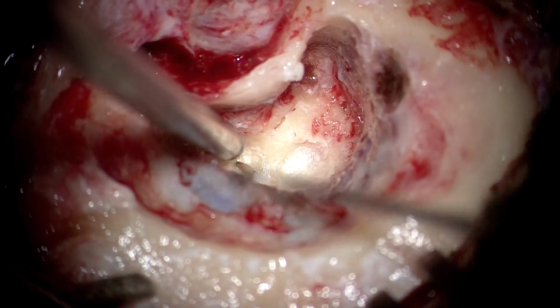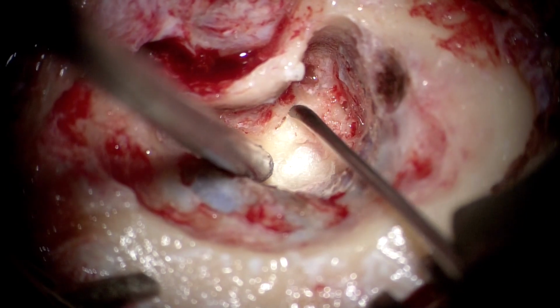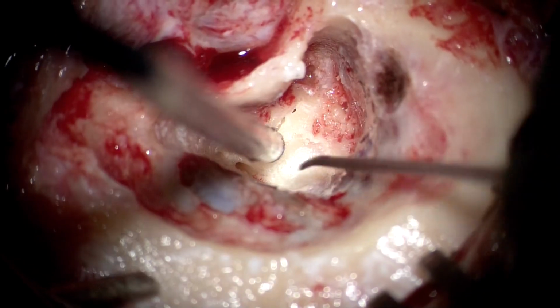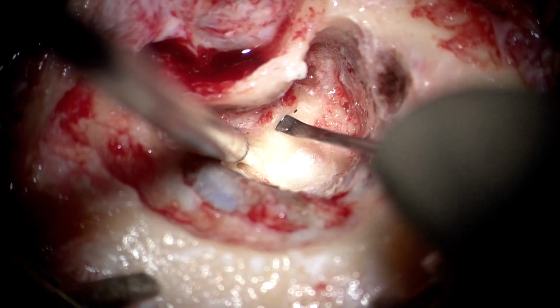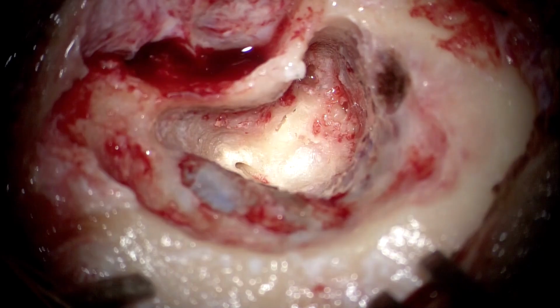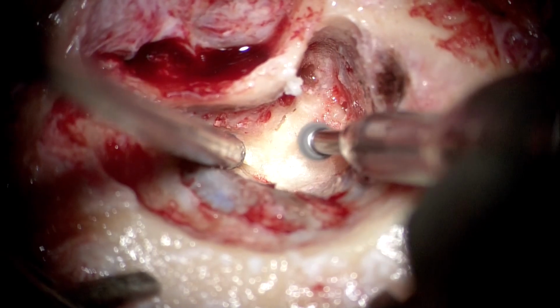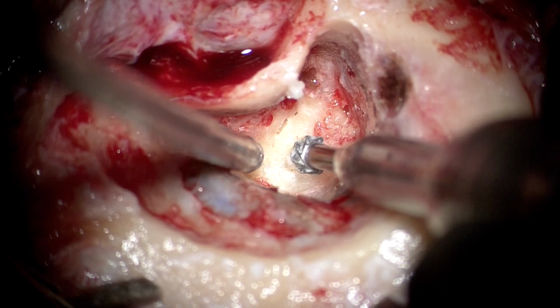And with the posterior canal now open, this one with the elevator points, you can see how closely it is hugging the sigmoid sinus. And if not for the sinus decompression, this step would be literally impossible, because you would not be able to drill that bone over the posterior canal. So to be able to expose the posterior canal, enough exposure posteriorly is very important, and if the sigmoid sinus has to be unroofed in that process, then so be it. It is done because it is compulsory and it is not optional.